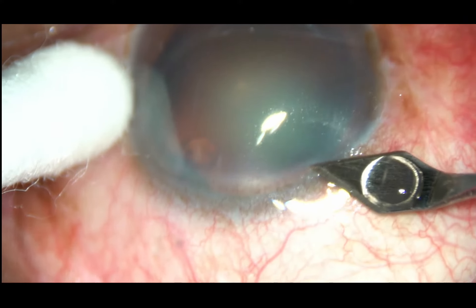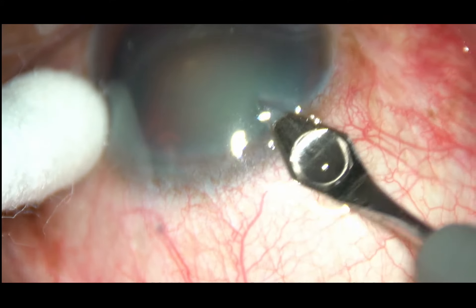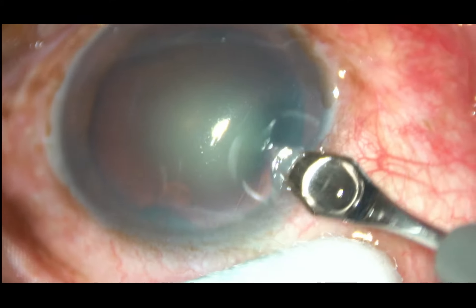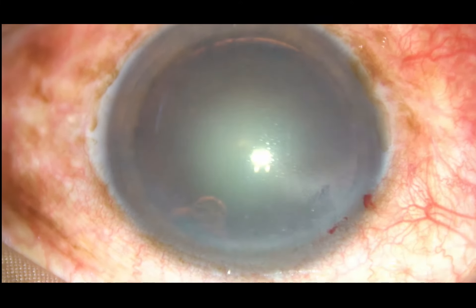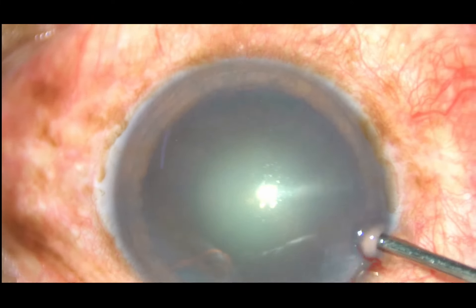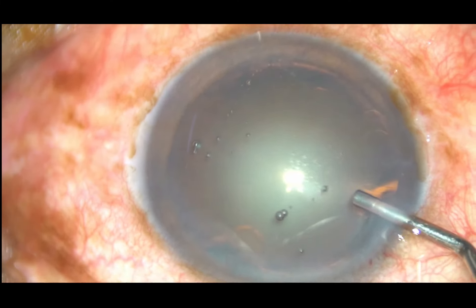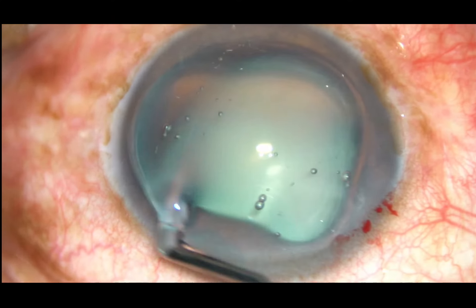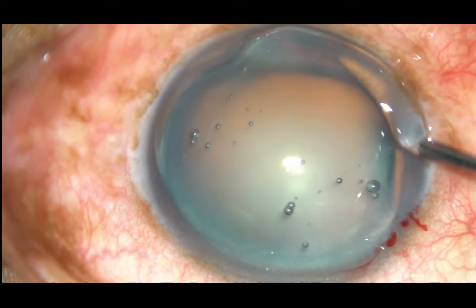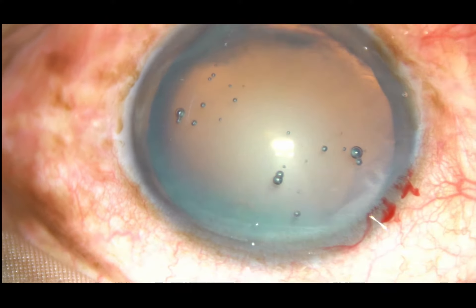The main incision is placed at a selected site. This is a 2.8 mm keratome and the incision is at the posterior aspect of the limbus — you can see oozing of blood. This is done intentionally. Viscoelastic substance is injected into the anterior chamber and spread over the corneal epithelium for better visibility and for epithelial protection.